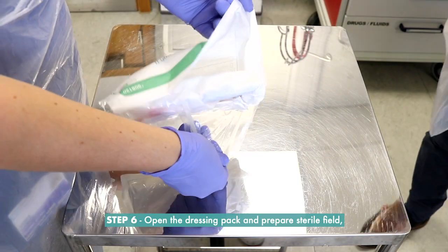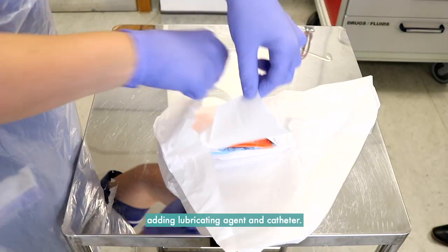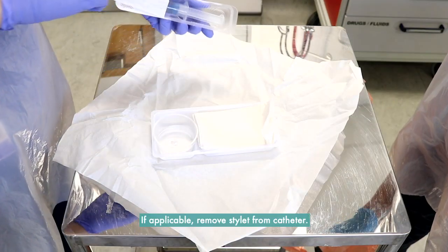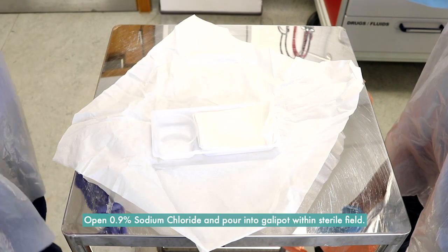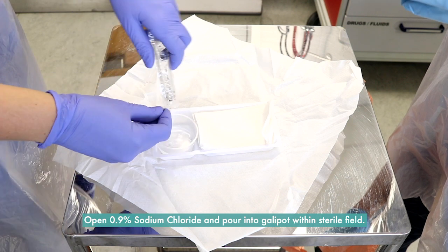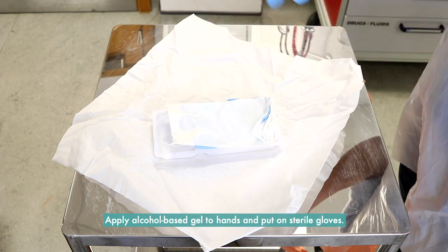Step 6: Open the dressing pack and prepare the sterile field, adding lubricating agent and catheter. If applicable, remove the stylet from the catheter. Open 0.9% sodium chloride and pour into the galley pot within the sterile field. Apply alcohol-based gel to hands and put on sterile gloves.